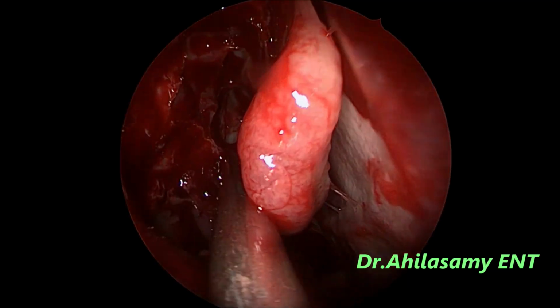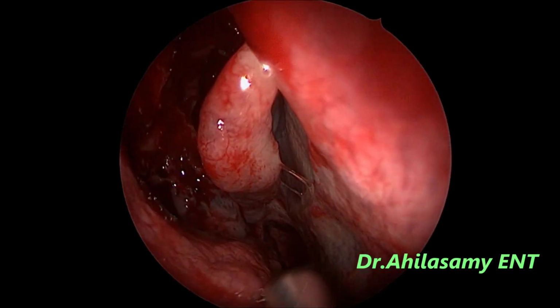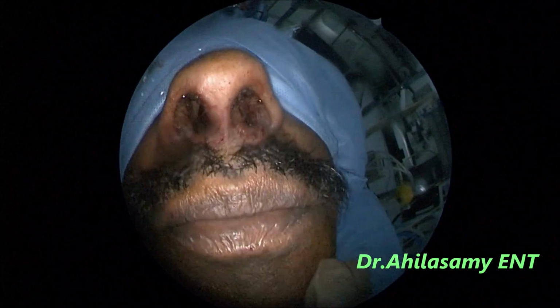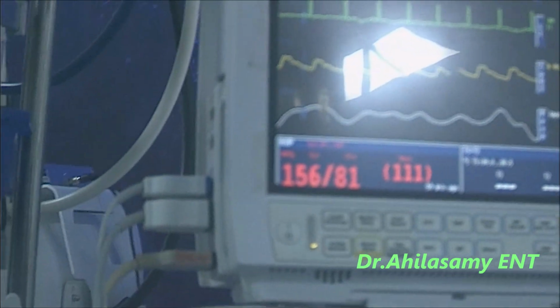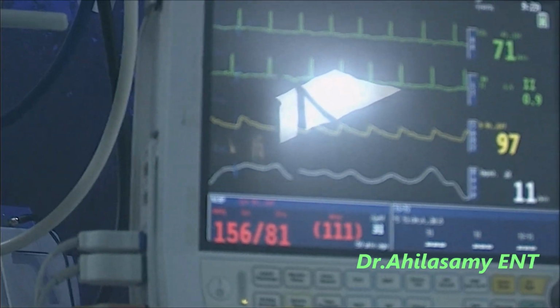This is a post-operative picture at the end of the surgery, and any blood collection in the nasopharynx, please suck it out. Hardly any collection in the oral cavity, throat also. You can see at the end of the surgery also the BP is around 156/81 and the pulse is around 71, saturation 97, no drop in saturation.